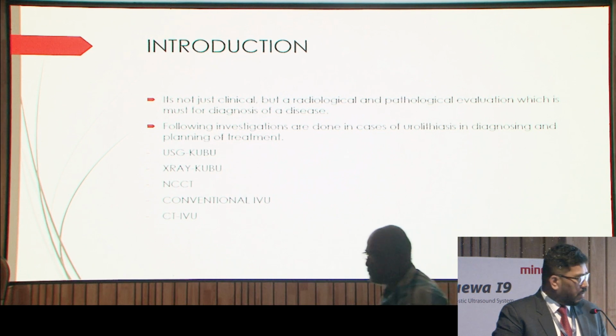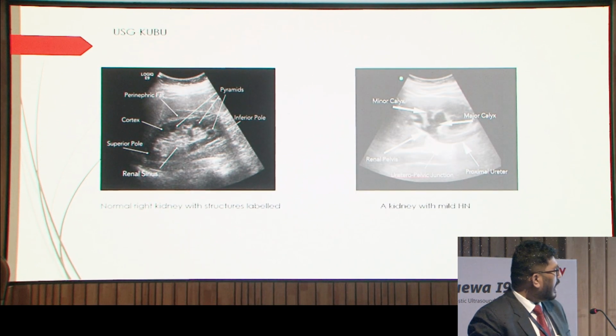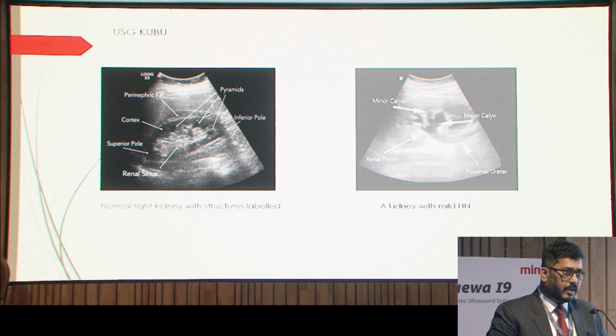We will go one by one. I have termed USG KUB-U because we want the urethra also to be included when we do this sonography. So it should be kidney, ureter, bladder and urethra.